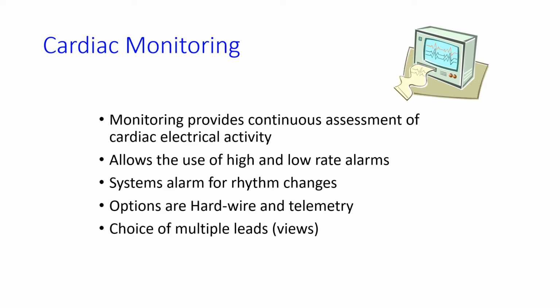So the benefit of these cardiac monitorings is that they provide high and low rate alarms. Normally you will have alarm rates, a lower and a higher setting, usually defaulted by the manufacturer, but your facility will oftentimes have in your policies what the low alarm and the high alarm would be set at.